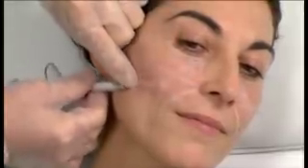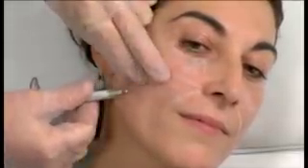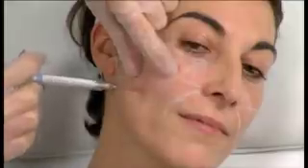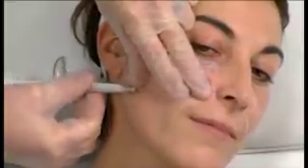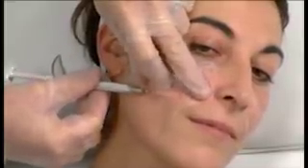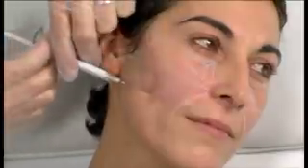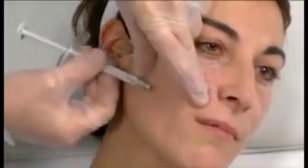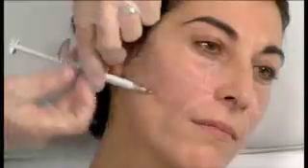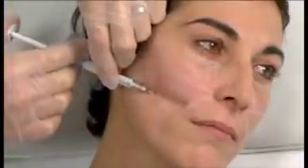So the downtime with cannulas is shorter. You have more swelling with cannulas, but you have less hematomas. The hematomas can last for a week, sometimes 2, and the swelling will last for a few days. One of the easiest areas to use the cannula, because it's the least fibrous, is the mid-face. So sometimes I will use that in the mid-face because that's where the ecchymosis tends to stay the longest and be the most visible, and then use needles elsewhere if the patient is fibrous and it bothers them to have the cannula. They can hear the cannula sometimes go through the skin.